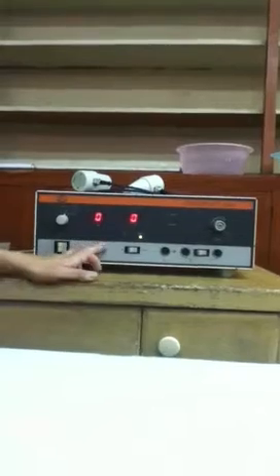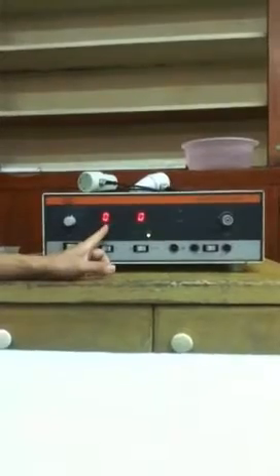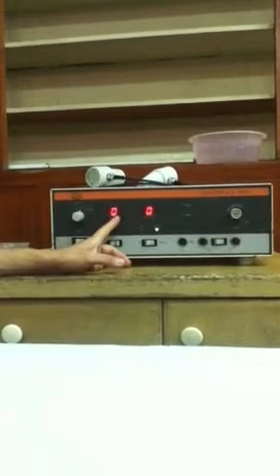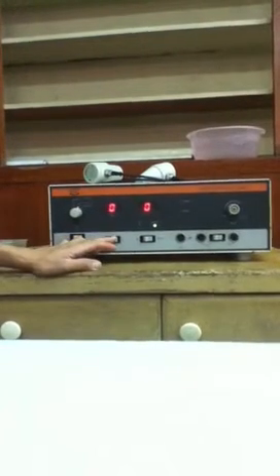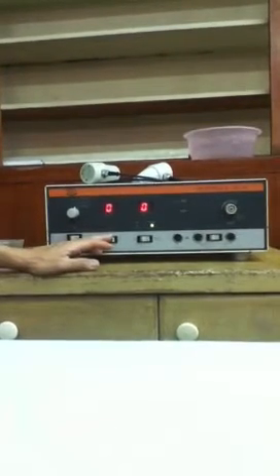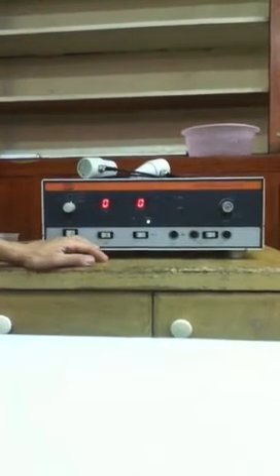Okay, next, this is the display setting for the time, in minutes. Usually the lecture gives how many minutes, but the parameters are in the animation by Miss Janice. In your book, it's 10. Usually in clinical practice, it's 5 minutes, but 10 is also possible.